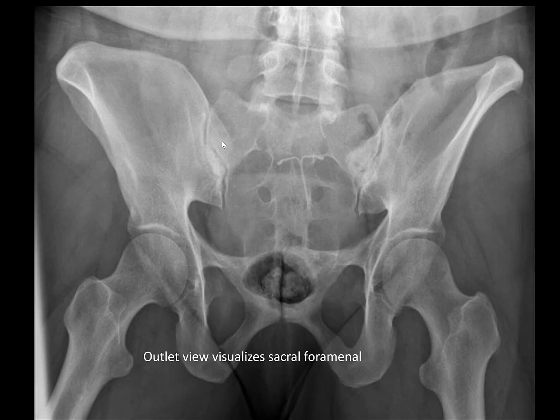So if you're going to truly try to compress the SI joint with something like screws, which is what we do in trauma, and is what I did when I tried to fuse these things, your bite and your fixation, if you believe the amount of fixation you put into it helps your fusion, aim at S1, don't aim at S2. That's my point. It's simple anatomy, but aim at S1, even though the joint is actually a little below that.